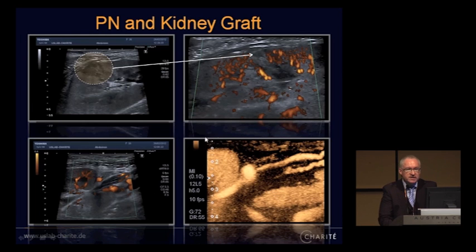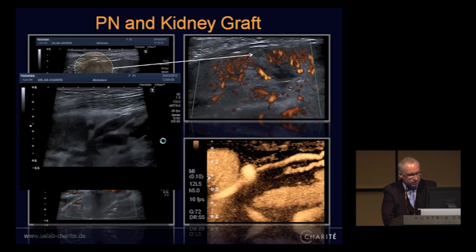Also a very interesting case, if you look at a booklet for ultrasound and you talk on pyelonephritis, it's a very hot topic. And you see here that's a case where we see an irregular shaped cortex of a transplanted kidney. There's a perfusion defect on a very small nodule here, and the reason is this ascending inflammation based on the ureter with a thickening of the wall, and this is the ureter very, very well perfused on contrast-enhanced ultrasound, and this is the situation in real-time B-mode scanning.